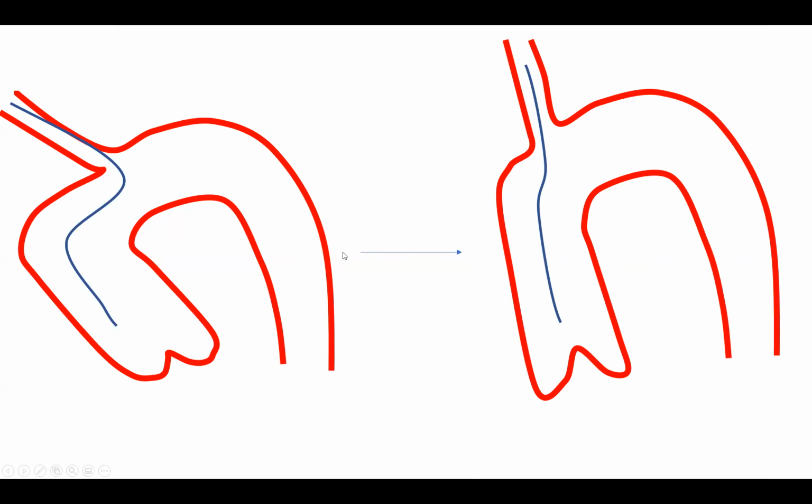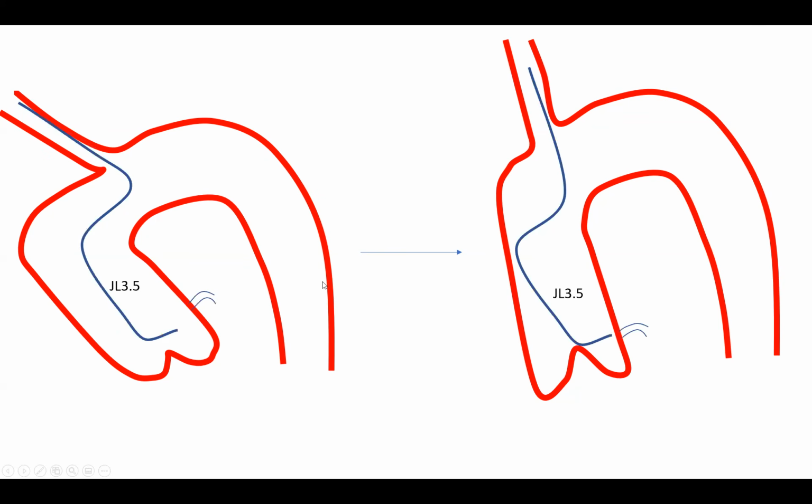So this is an illustration for if you couldn't understand why deep breath works. Deep breath changes that angle of innominate into ascending aorta. You take a deep breath, you elongate the whole chest and everything inside the chest, all the structure and arterial structure. So that angle becomes, rather than being sharp, more favorable. Even the aorta becomes longer. So the aorta becomes longer, the angle here becomes more favorable.